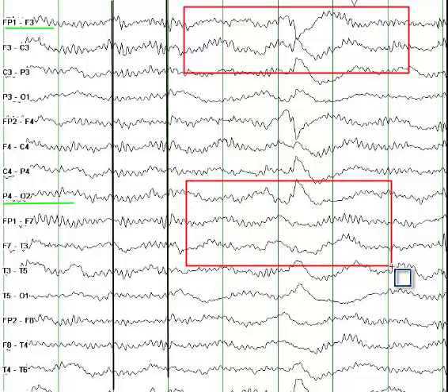But on external stimulation, you can give some kind of painful stimulation to the patient. You can just make a loud sound and see if the alpha frequency changes or not. If the alpha frequency does not change and it is distributed anteriorly and posteriorly in a comatose patient, you call the EEG pattern alpha coma.